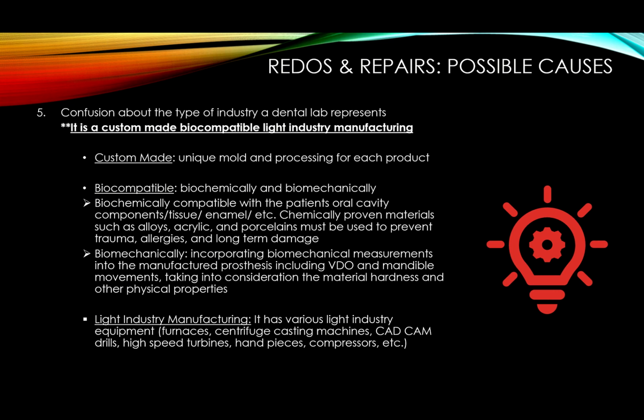You can't use this flux, you have to use that flux. You can't use this, you have to use that. This has to be dental approved, not just manufacturing grade, like any torch, any metal, any casting. No, you have to have the right polishers, the right everything, because you will find polishers and greenstones and all kinds of abrasives and handpieces that go with other industries, not with what you are doing, okay? If you use them, you will contaminate your porcelain. You have many problems, all right?